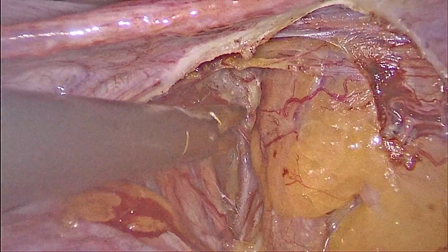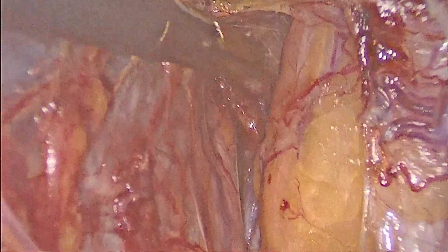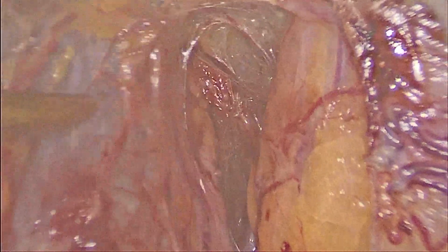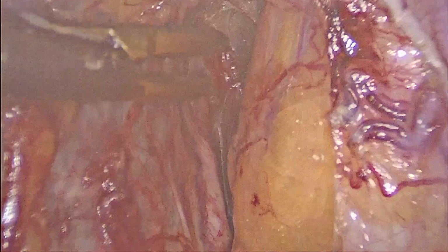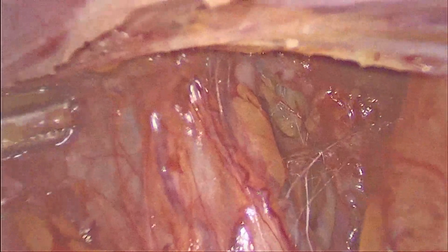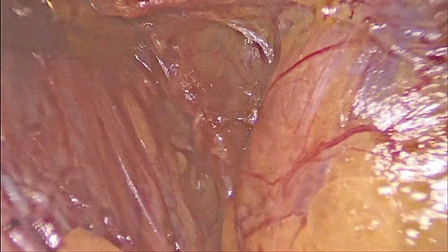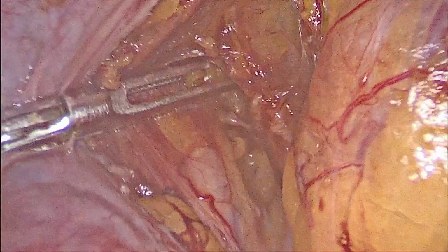Bipolar shears are very good to dissect in this plane, giving enough hemostasis, and the blunt tip, which is atraumatic, gives an advantage in dissection in this area, preventing injury to the vessels. Very close to the uterine artery, deep to it, is the uterine vein. Try to separate the uterine vein from the uterine artery to ligate the uterine artery.